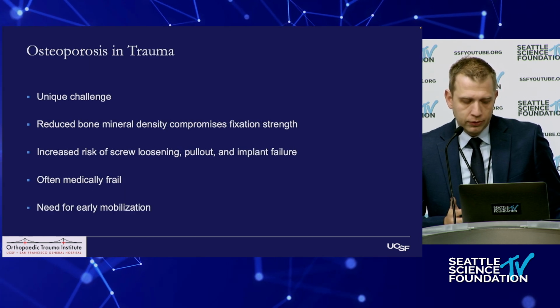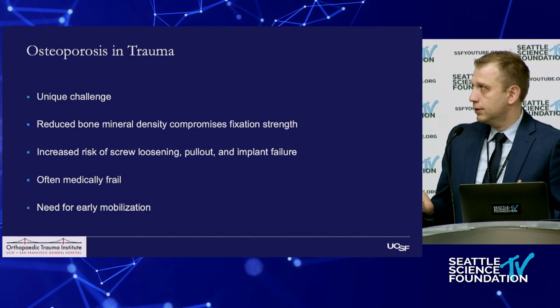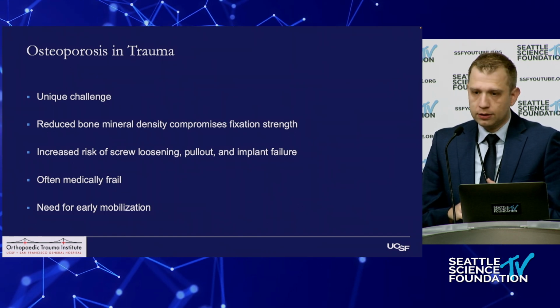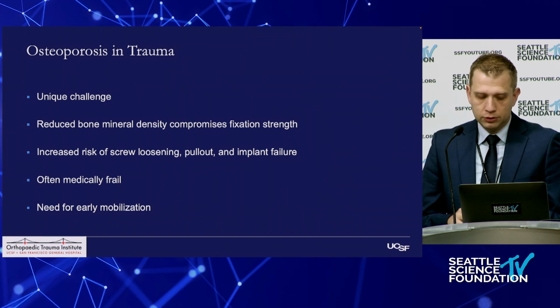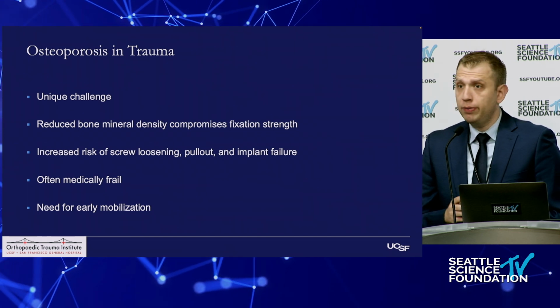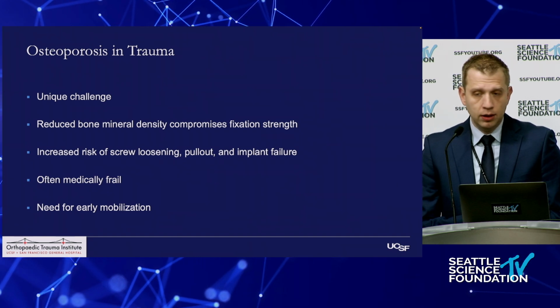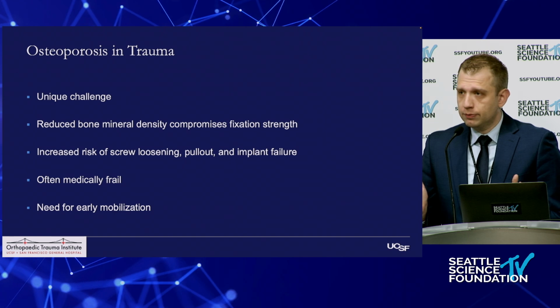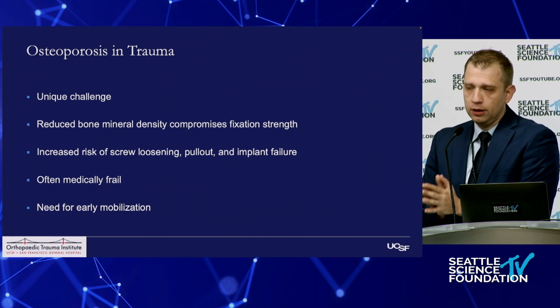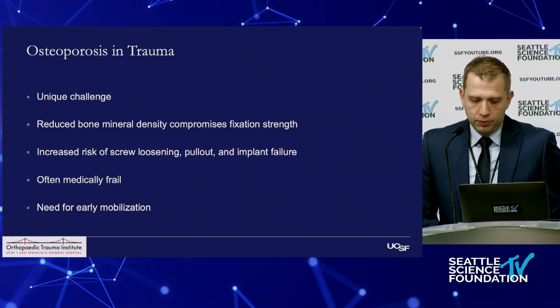And so it poses a unique challenge, and this is due to the reduced bone mineral density, which compromises the fixation strength of the screw. This increases the risk of complications such as screw loosening, pullout, implant failure, adjacent level fractures. These patients are often medically frail as well, and as part of the AO mission, we want patients getting up and moving. We don't want them to be bedbound. So there's also the need for early mobilization.